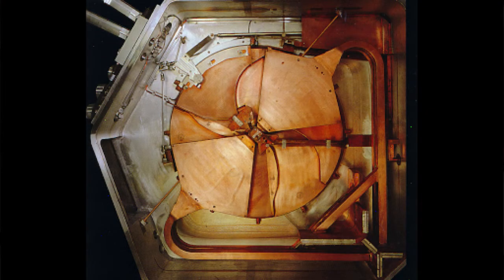So what we have in there in a cyclotron is called Ds. They would be straight in a linear accelerator. But the Ds are RF cavities. Let's say we have a negative particle. The D, as it's in this little orbit, will be positive, and the particle will get attracted to it. As it gets attracted, it gains kinetic energy. Then it drifts a little ways, and we know the orbital frequency. As soon as it reaches the end of the D, which has tips in a hollow cavity, it changes from positive to negative, it gets repulsed, and it has a little more kinetic energy. It's going faster, but with the same frequency.